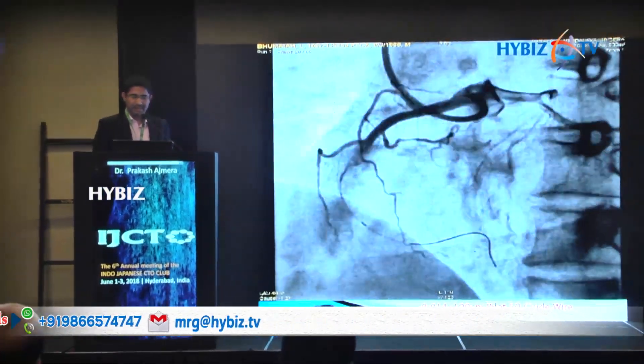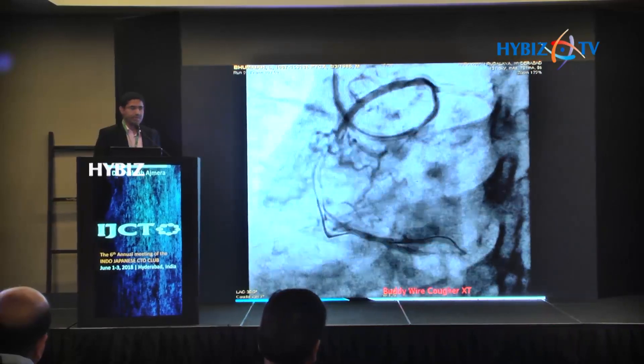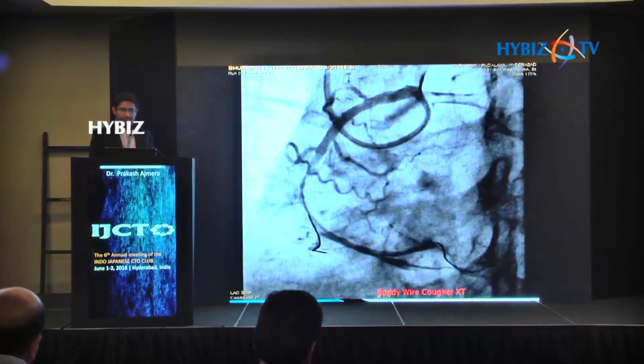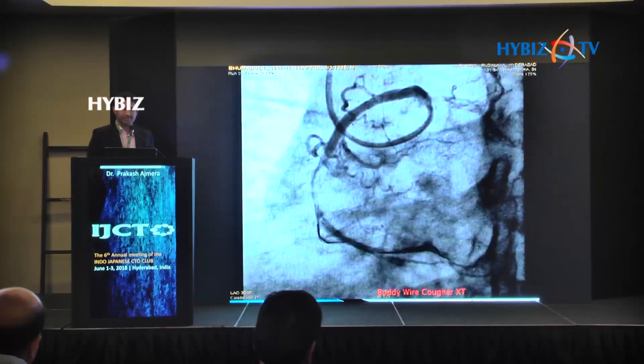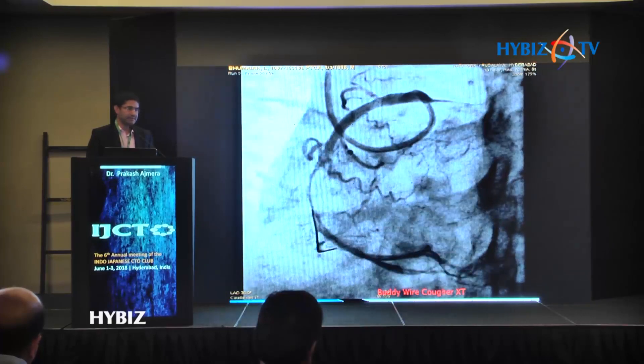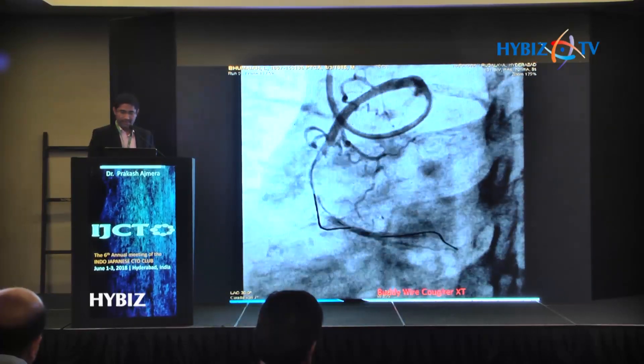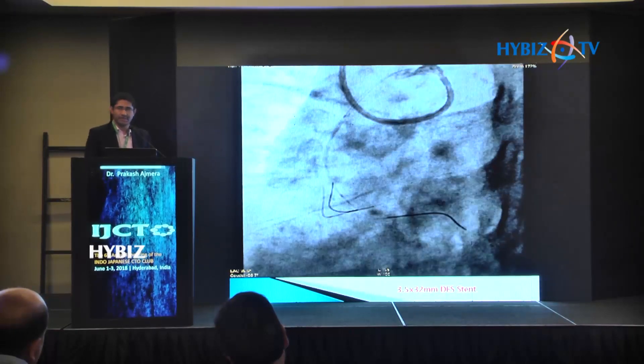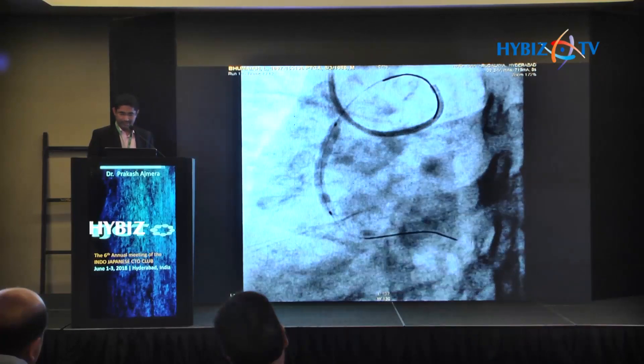This time we took JL 3.5 guide catheter and luckily we saw some faint filling, likely because the first attempt had ruptured the cap and the Fielder FC wire had gone in, but we still could not negotiate the balloons. So first we used the buddy wire technique — a normal Sion XT wire kept into the branch — which gave the catheter some stability. Then we did graded ballooning: 1.25 x 8 mm balloon, then 2 x 15 mm Sapphire balloon, and finally a 3.5 x 32 mm drug-eluting stent, which went well.